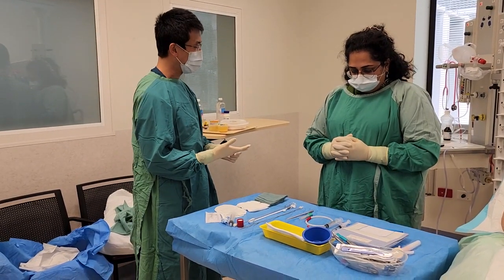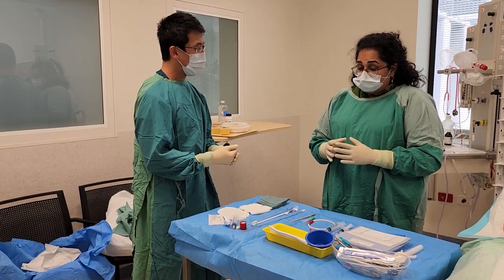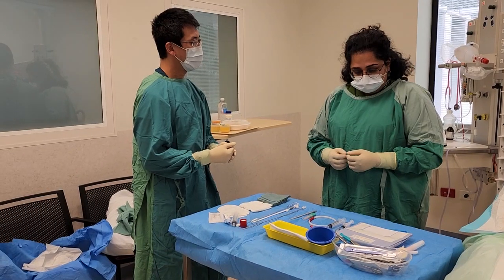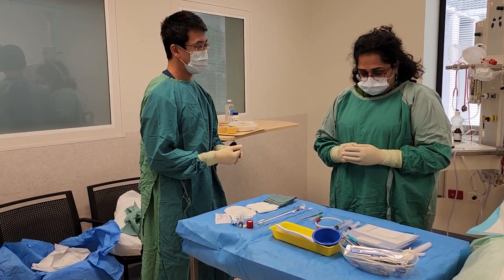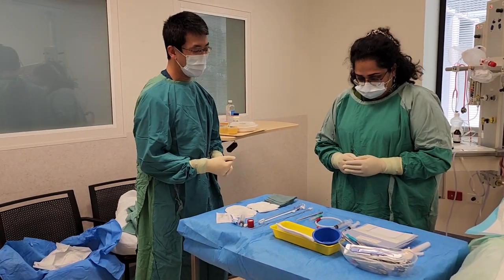And what are your experiences in terms of putting in chest drains? I have seen chest drains being put in. I have not put in a chest drain myself. So this is a learning opportunity. Wonderful. So once again you'll be the primary operator, and I'll be assisting you.